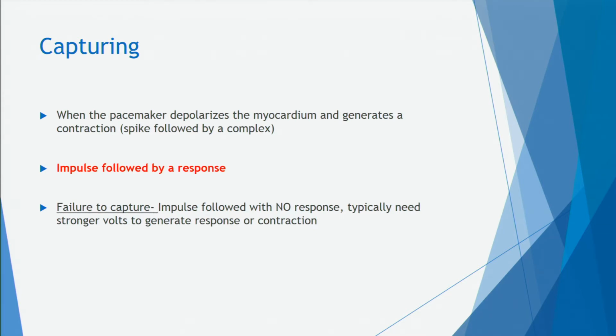Have y'all ever cardioverted or seen cardioversion? All right, so the first thing you do is, I want to know what the heart is doing, right? So I'm going to synchronize. They're not in VFib. We're not just randomly defibrillating, right? They have a rhythm. And when you synchronize, you get these spikes right above each complex. So this says that the machine knows exactly what the heart's doing, and it's tracking it so that we don't interrupt the normal activity and we shock at the right time, right?